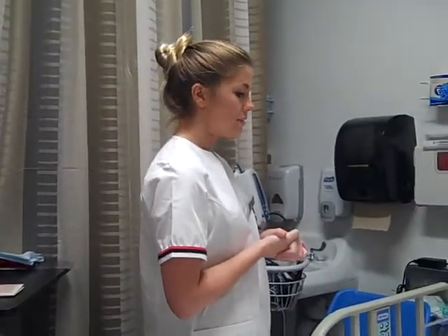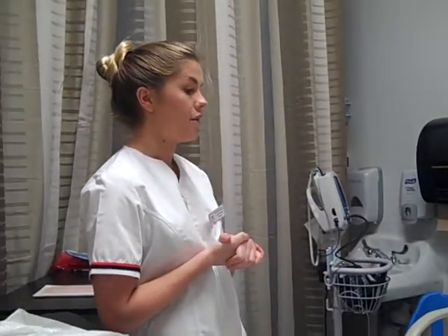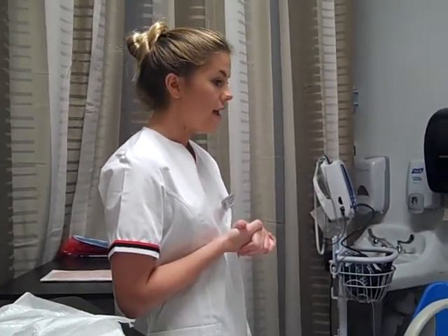All right, thank you. Do you have any allergies that I need to be aware of? Okay, and then I will explain my procedure to the patient. I'll let them know that I am going to be changing out their dressing for today.